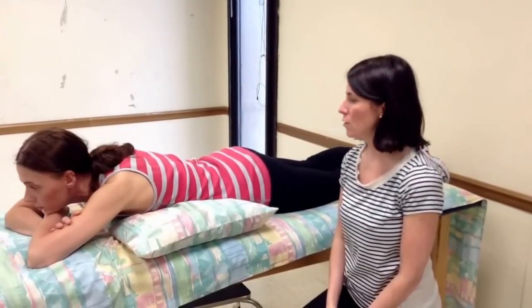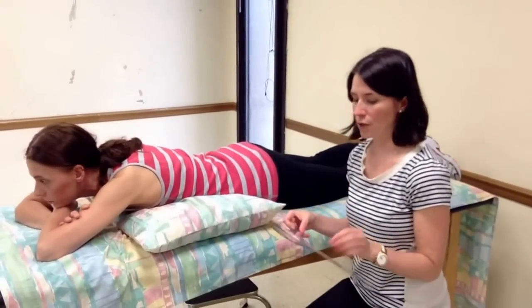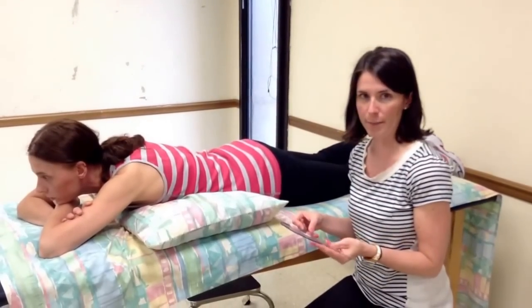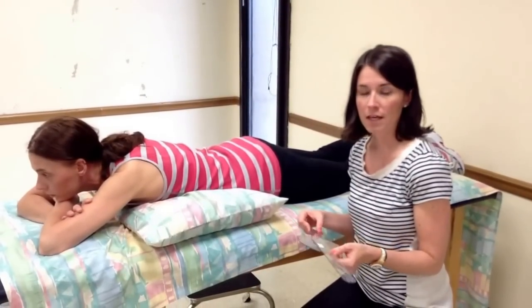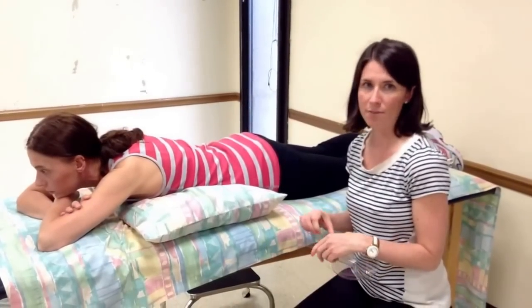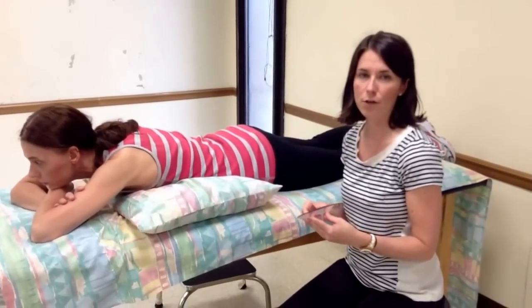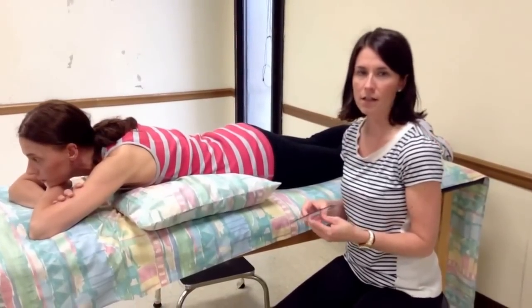This video is going to demonstrate goniometric measurement of hip extension. Hip extension occurs in the sagittal plane. It has a firm end feel and the normal value is 0 to 20 degrees.